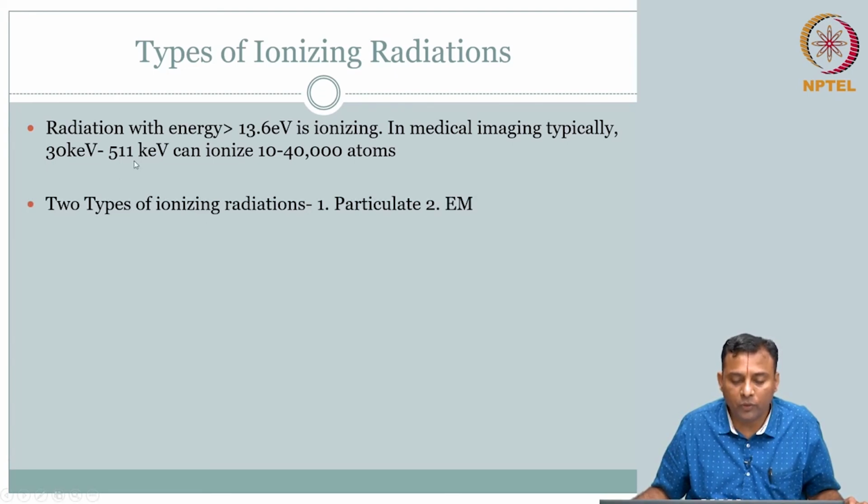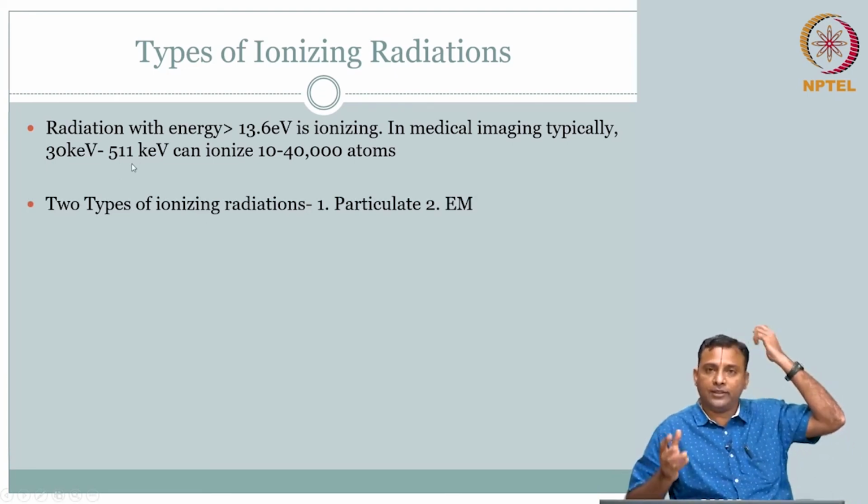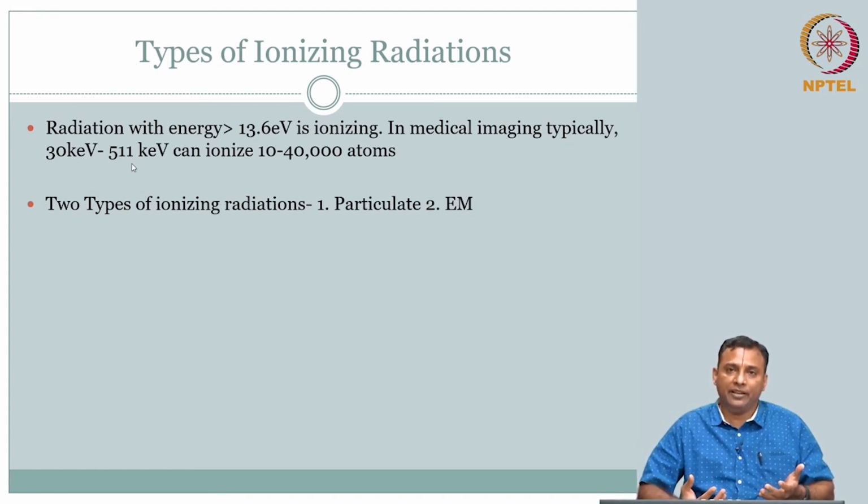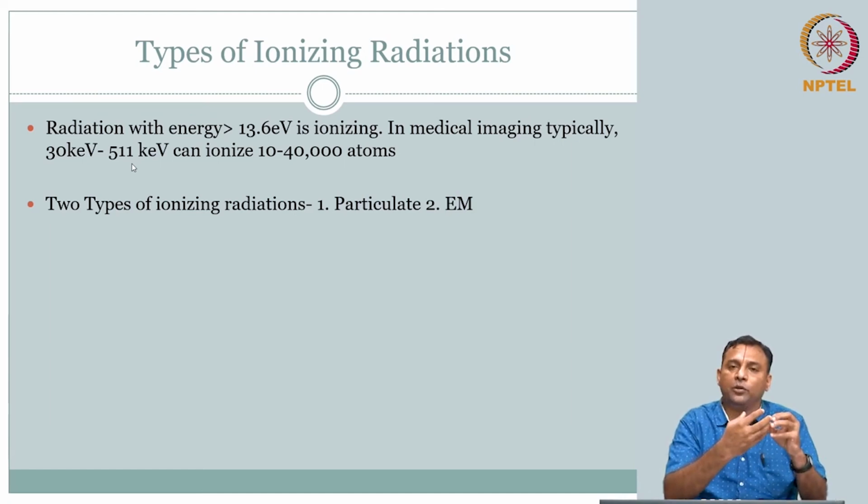Now the question is, how do you cause ionization? Actually, you don't want to cause ionization, let me not phrase it that way. How much radiation do you need to give, and how do you give it? These are two aspects. In the X-ray tube example that we saw, we wanted to create ionization. Why? Because ionization itself is not an issue. After ionization, what will happen? It will try to go back to its ground state and therefore give out energy in a certain characteristic range.